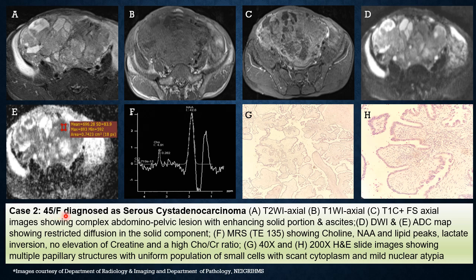The second case was a 45-year-old female diagnosed with serous cystadenocarcinoma. The T2-weighted axial, T1-weighted axial, and T1-weighted post-contrast fat-suppressed axial images all showed a complex abdominopelvic lesion with enhancing solid portion, cystic spaces, and ascites. The trace diffusion image showed intermediate signal, and the ADC map showed low values indicating restricted diffusion in the solid component. Multi-voxel MRS at TE 135 showed a choline peak, no creatine peak, an NAA peak, lactate inversion, and a lipid peak, with a high choline-creatine ratio. The 40x and 200x H&E slides showed multiple papillary projections with uniform population of small cells with scant cytoplasm and mild nuclear atypia.